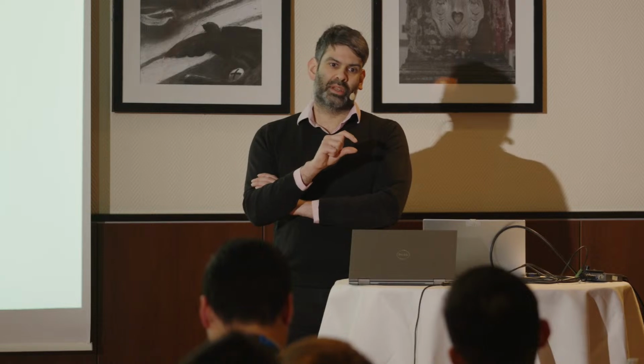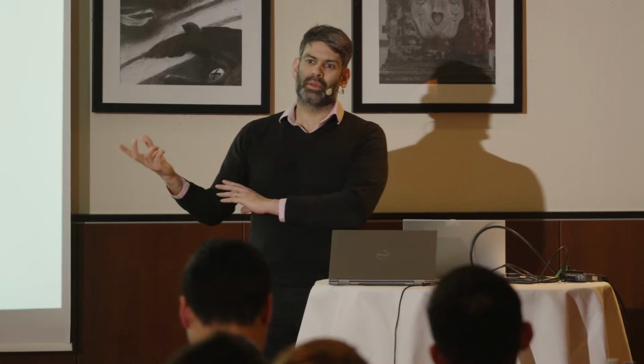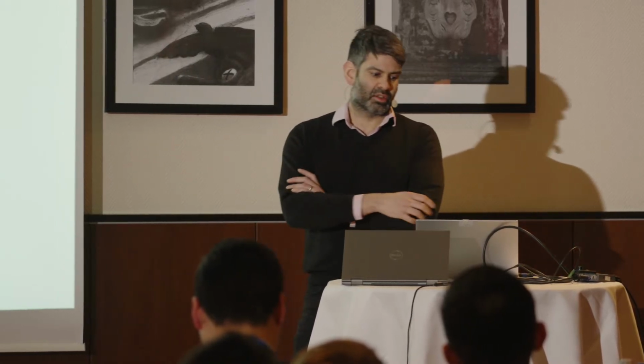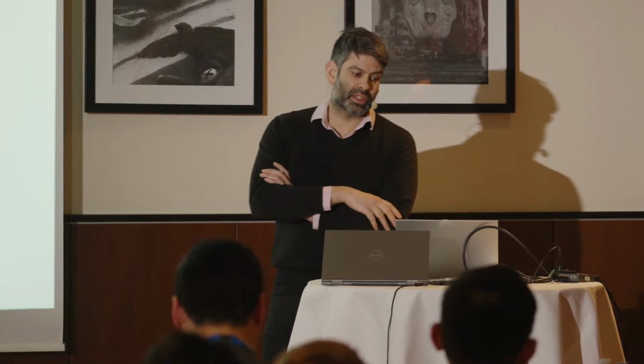And crucially, what we're finding with IVUS is that you don't get the full information on disease extent. I've seen angiograms that look pretty much completely normal, and then when you look on an IVUS, you can see there's a 30% rim of soft plaque all the way around it, that if you have the edge of a balloon in that plaque, is going to immediately cause a dissection at the edge and make things look worse than before. So it can be very misleading, particularly if you do angiography only in a single plane.